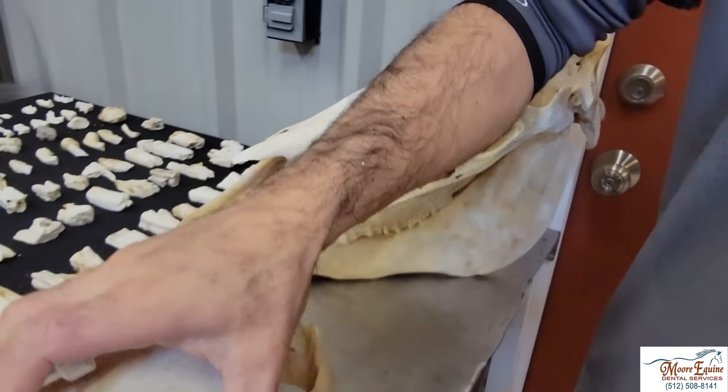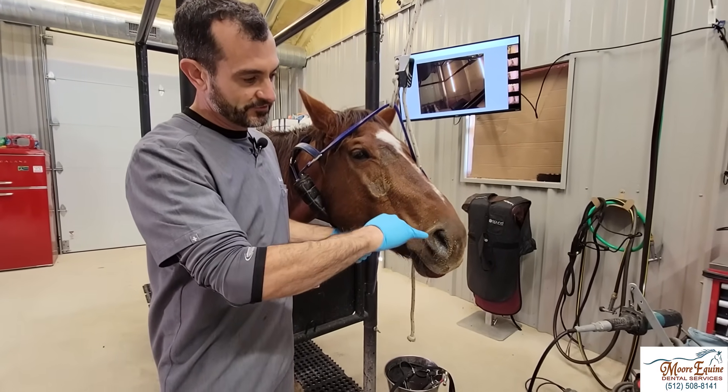We're going to show you a way to flush the sinuses. The horse we've got had an extraction about 10 days ago, had a sinus infection, and there's still a little bit of residue. We're going to try and help flush out some of that pus in a minimally invasive way — very easy and simple to do. You can't really tell it's been done the day after because we're just going in using needles. We can see some discharge on this horse.